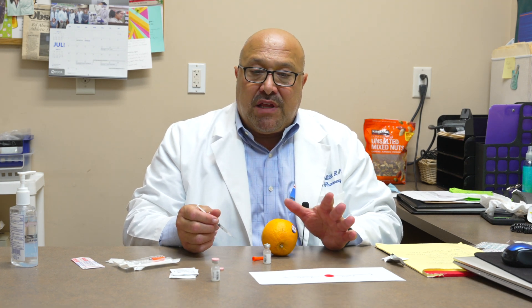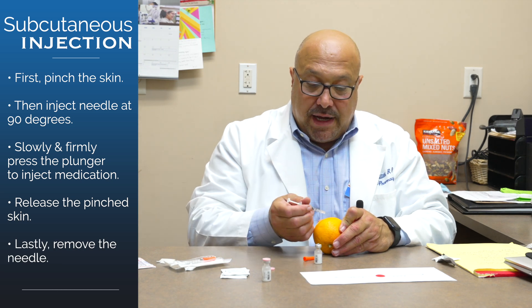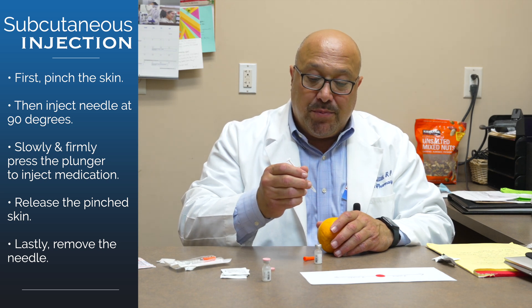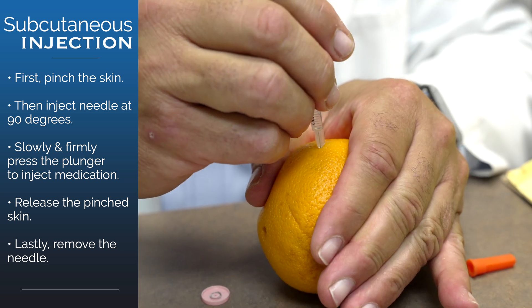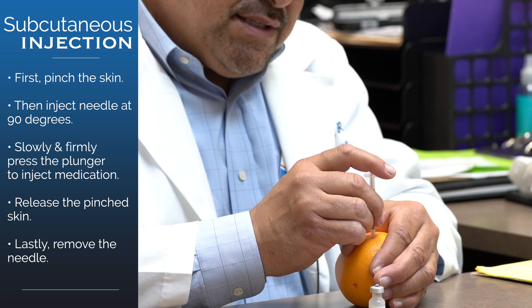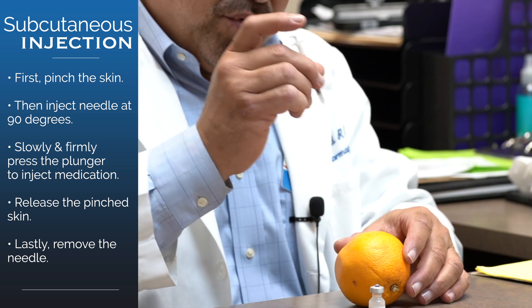Ninety percent of the time you want to go in at a 90-degree angle — that's straight in as opposed to on an angle. If you are an extremely thin person, sometimes you need to use a 45-degree angle, but most people would not need to do that. So, with the skin pinched, going in at 90 degrees, slowly and firmly inject and depress the plunger. Once you're all the way to the bottom, release your hand, then pull the needle out slowly.